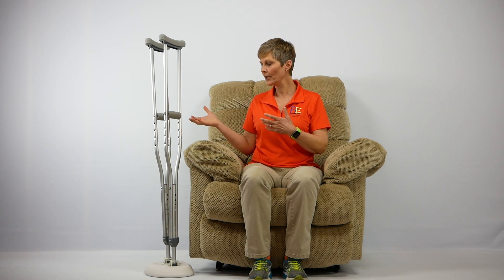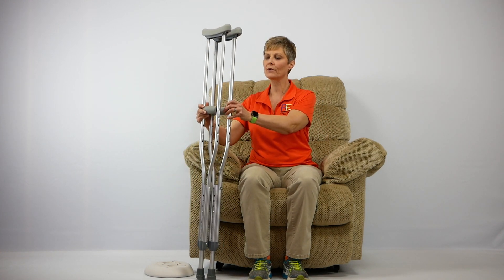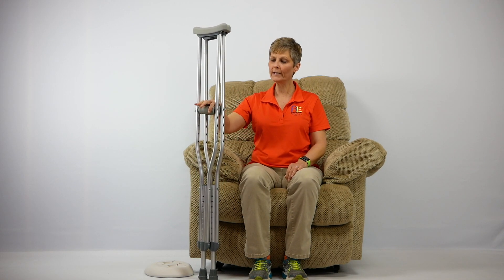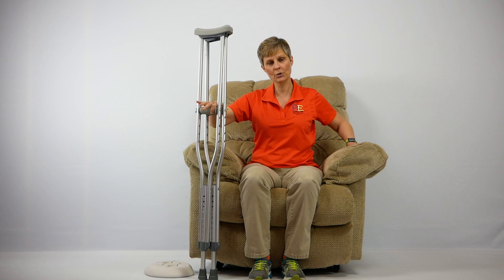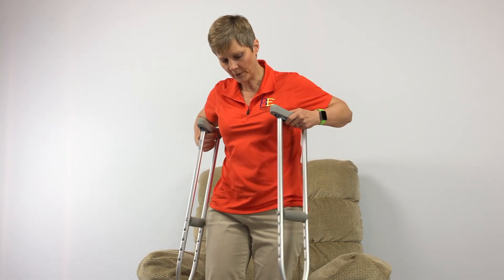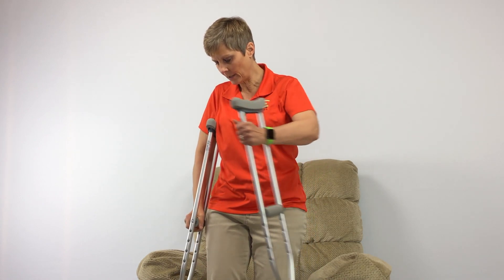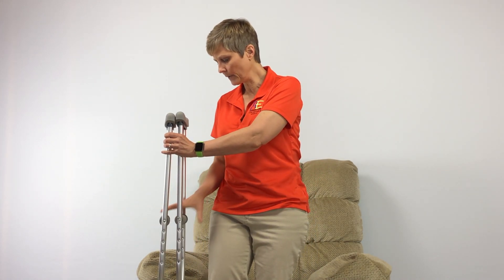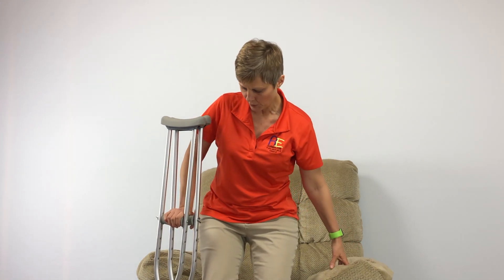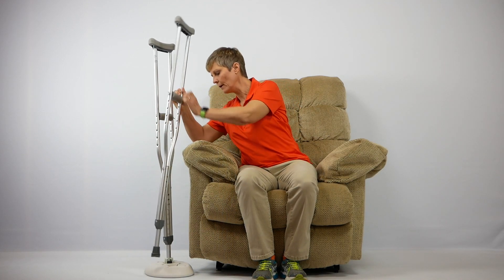If I was using this at my seat and was non-weight bearing on one leg, I wouldn't stand up first and then grab my crutches. I would actually take the crutches out of the Crutch Caddy first. I have it on my dominant side, which is my right side, giving me good stability. I push on the crutch and push up from the chair into a standing position, then adjust the crutches to each side of my body. Coming back to sit, I use the crutch for stability, reach back for the chair, have a seat, and then easily place my crutches right back into the Crutch Caddy.